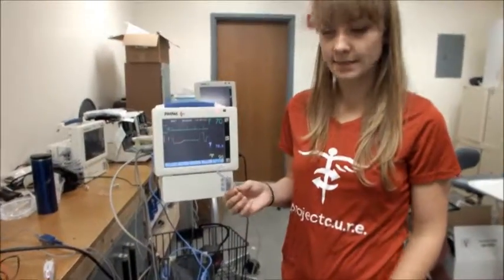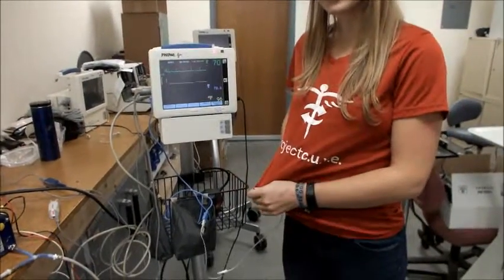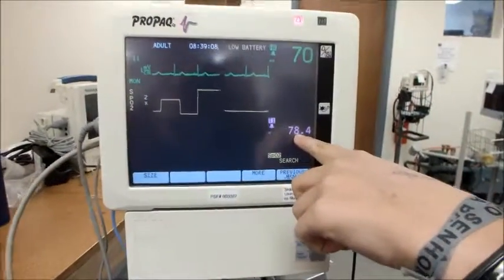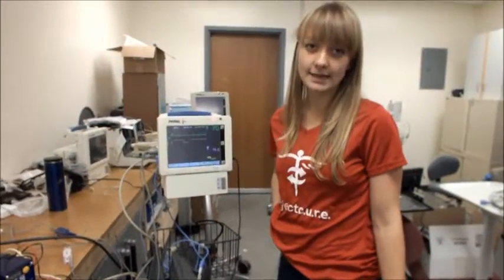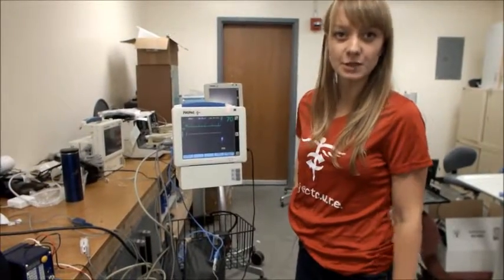The next easy thing to check is the temperature. Simply place the temperature probe into your hand or put it on your stomach under your shirt, and you should see a temperature number close to body temperature — about 98 degrees Fahrenheit or 37 degrees Celsius on some machines.